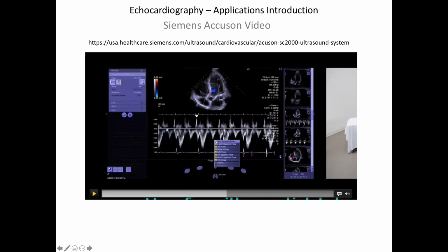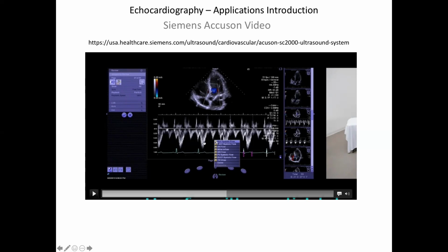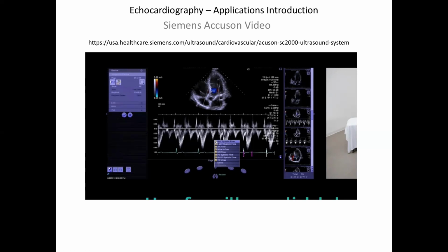Now this is through the aortic valve, right? And you can see basically the width of the pulse. We get to our peak velocity through the aorta, and then a decay as the pressure is reduced from the ventricle. So you hit your peak velocity of the blood going out the aorta. And then as the ventricle is finished contracting, it still stays at the end systolic configuration, and the blood starts slowing down, right? And so you can measure the decay rate of this to look at basically how much pressure is there downstream.